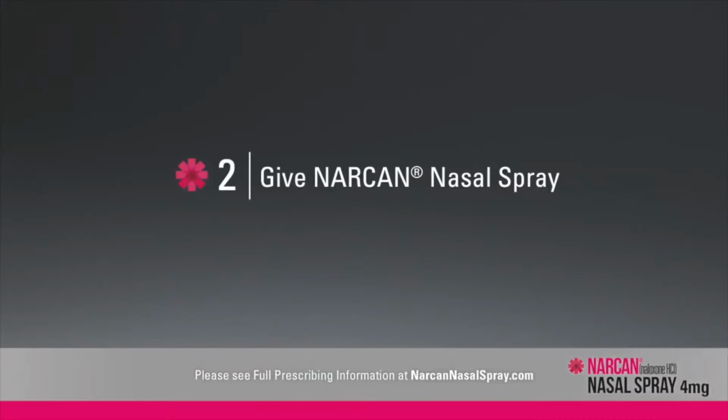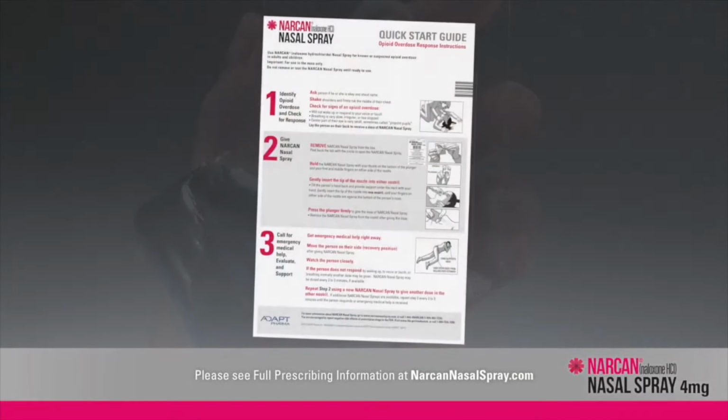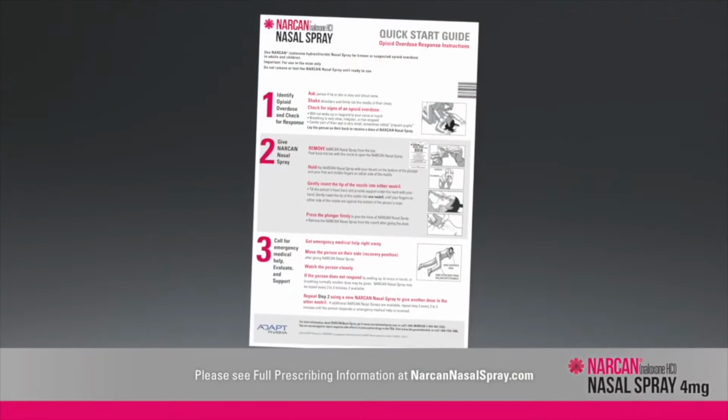Administer NARCAN nasal spray as quickly as possible if someone is unresponsive and an opioid overdose is suspected, even when in doubt, because prolonged respiratory depression may result in damage to the central nervous system or even death. Lay the person on their back to receive a dose of NARCAN nasal spray. Remove NARCAN nasal spray from the box. Peel back the tab with the circle to open it. Remove and review the printed quick start guide inside the package.